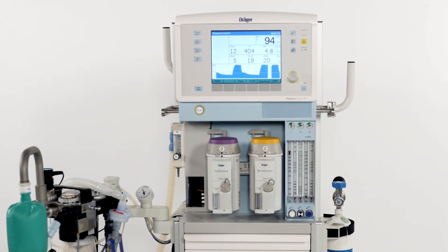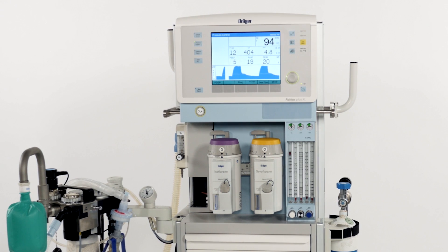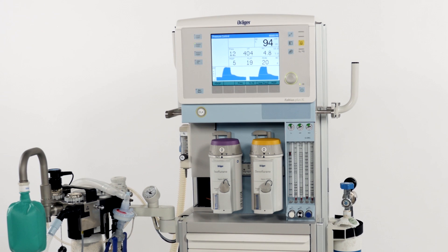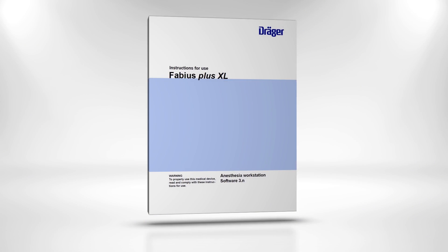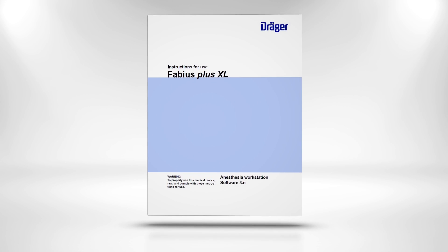We are now going to show you how to prepare your Fabius in the morning and before each case. The first thing to be done in the morning is the daily checkout procedure to ensure that your Fabius is up and running. In your instructions for use you will find a detailed description of each and every step we are going to go through.